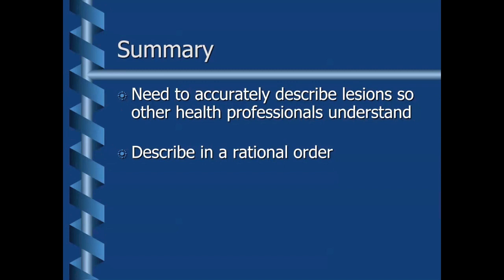You need to describe in a rational order. So think about those 5 steps in describing lesions, and stick to that rational order so you don't miss anything.